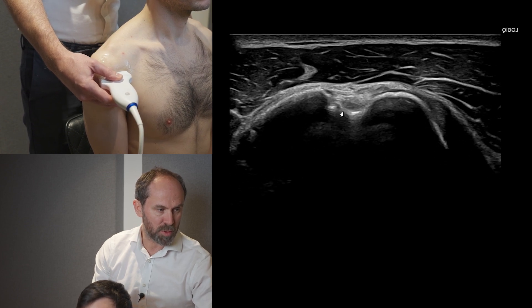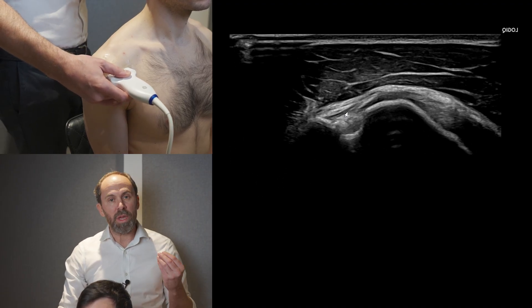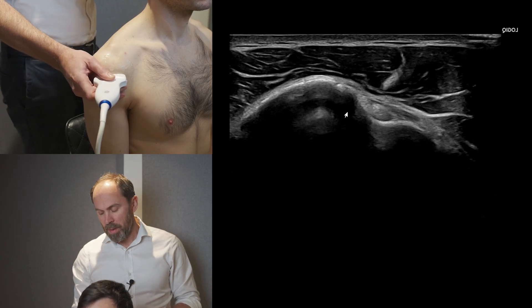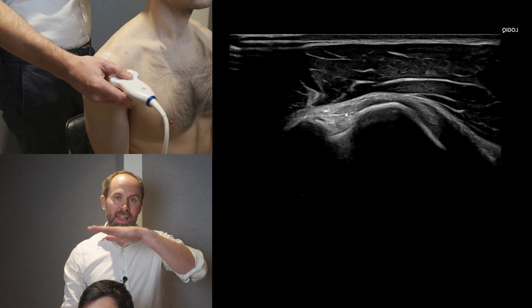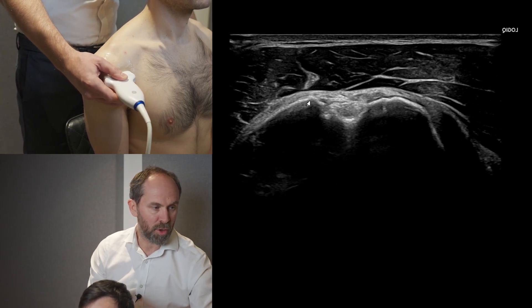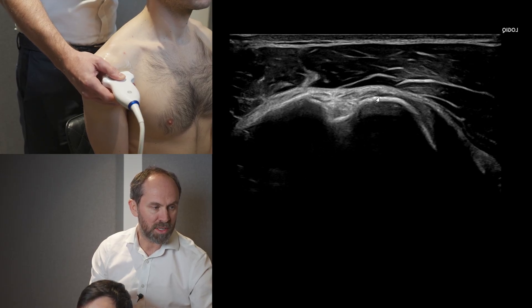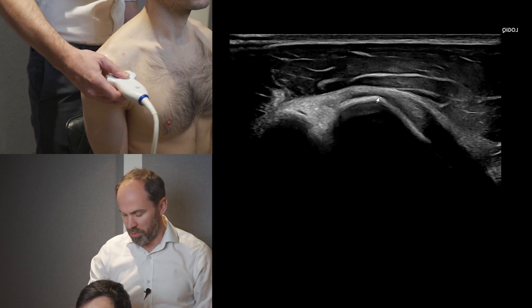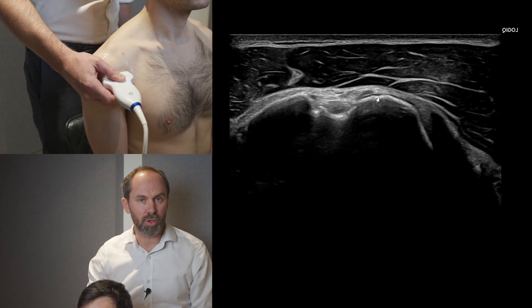Here's the bicipital groove. To optimize the image, use the heel and toe of your probe to get the lesser and greater tuberosities lined up and level. You can see the greater tuberosity and the lesser tuberosity — they should be level. Tilt the probe to make sure the bone is bright and you're good to go.